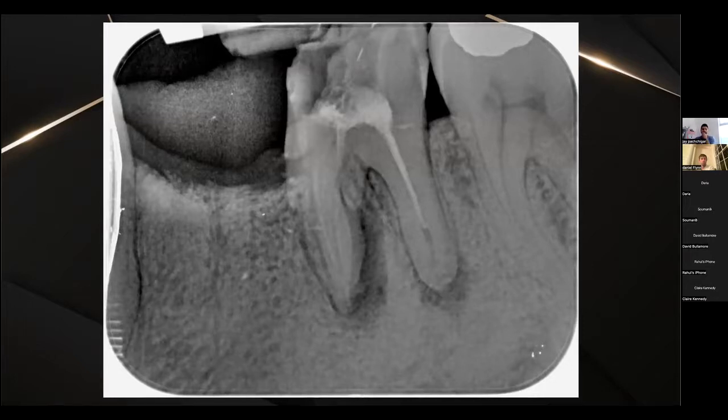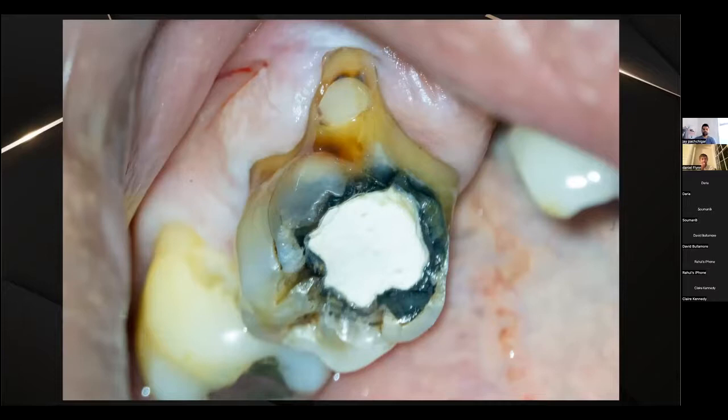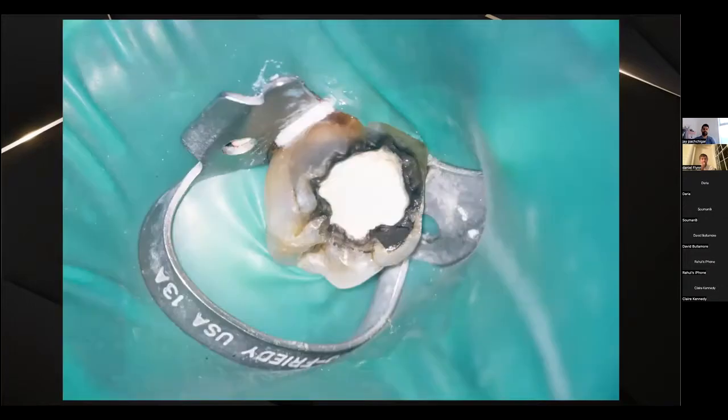This is actually quite an interesting one because you've got that J-shaped lesion. It's heavily broken down. The tooth in front is missing. It very much looks like a fractured tooth. The main reason I even decided to go ahead was there was no pocketing. So I thought, okay, let's give it a go and see what's happening.